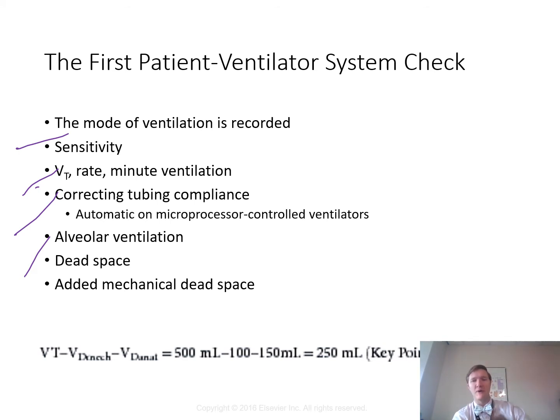Or even when someone went into ARDS, when they went to a low tidal volume like a 4 mL per kilo strategy, 4 to 6 mLs, then we'd have to chart the amount of dead space. And the advantage there is that it communicates, hey, we can actually retain less CO2 if we get rid of some of that. Some of that's not essential. Let's get rid of it if it's not essential. All right, so that's what we're looking at here.